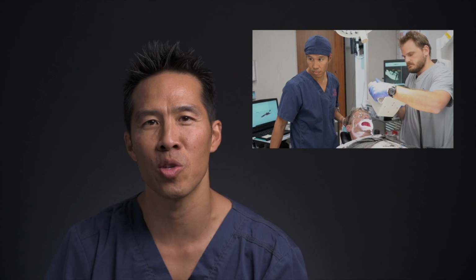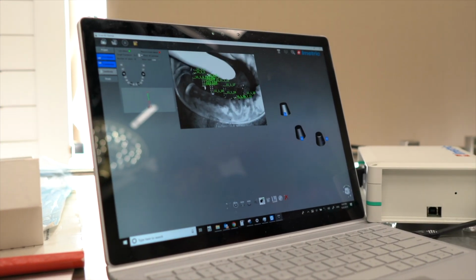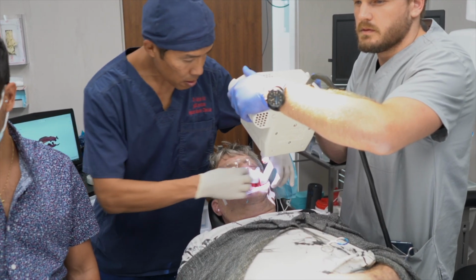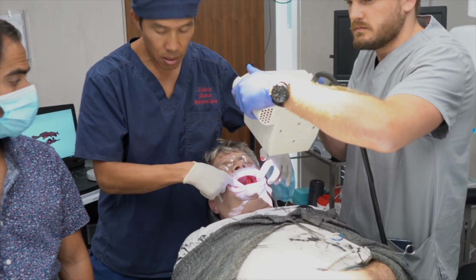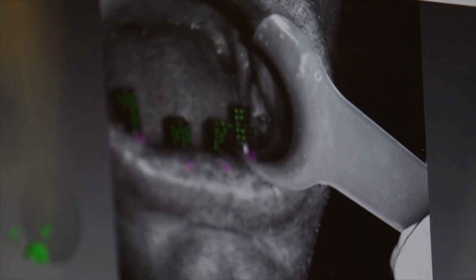And what this allows us to do is actually get a precise idea of exactly where the implants actually are, so that we again don't have to take models or impressions during surgery. Again, this is to ensure that it's a lot more comfortable for the patients, but also that it's very precise and very accurate so that we know that the result is predictable.